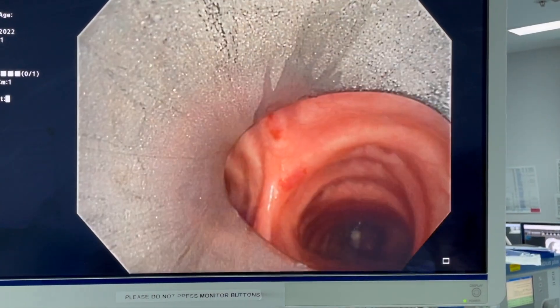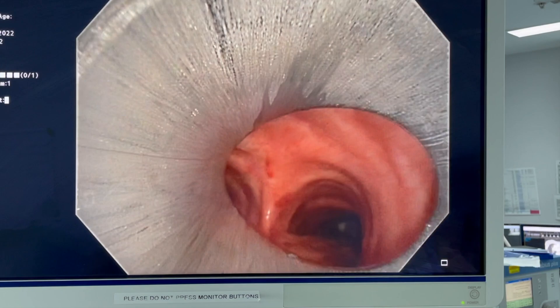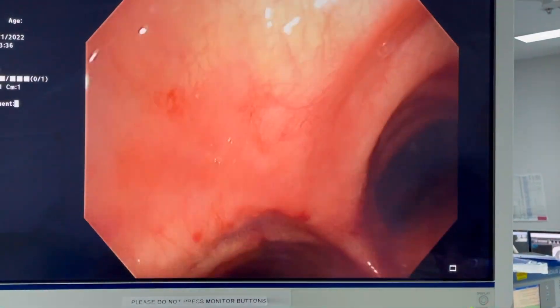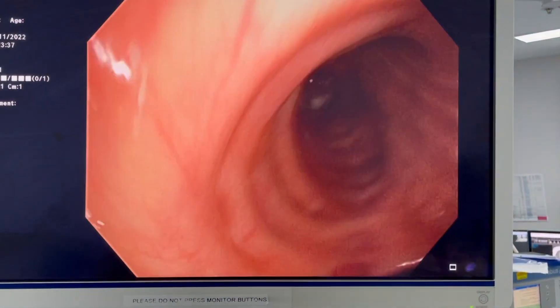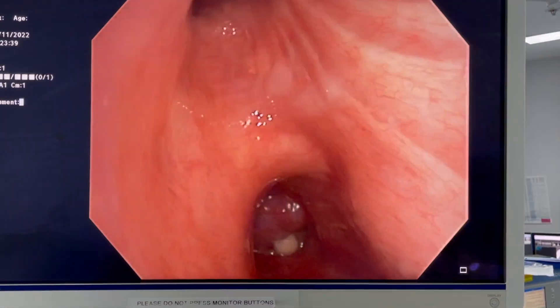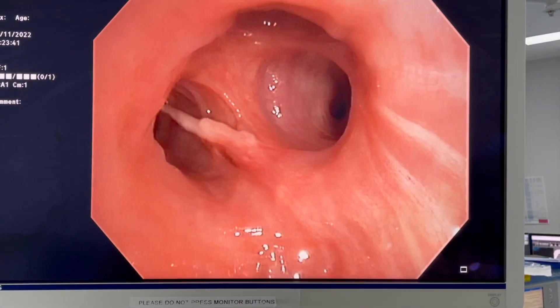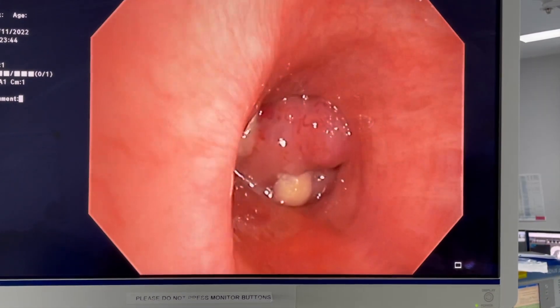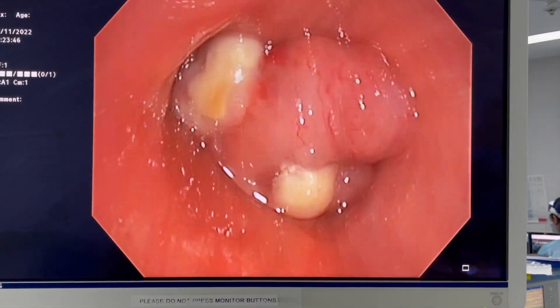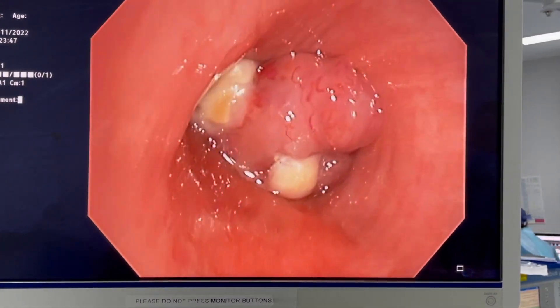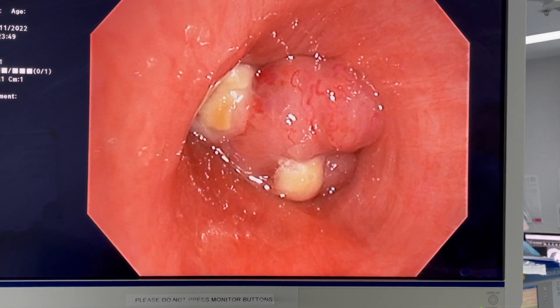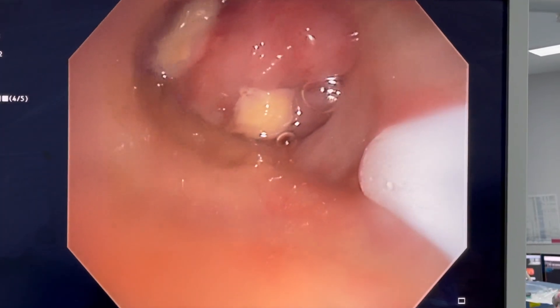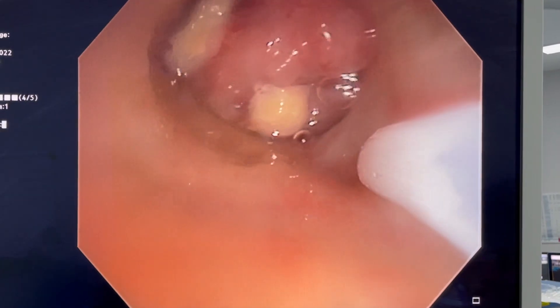I'm now using a flexible bronchoscope through the rigid to get a really nice view of the airways. Here's the right main bronchus and there's the right upper lobe, which looks clear with just a little bit of mucus. And there you can see a tumour with areas of necrosis, almost completely obstructing the lower lobe and probably partially blocking the right middle lobe, consistent with what we saw on the CT.